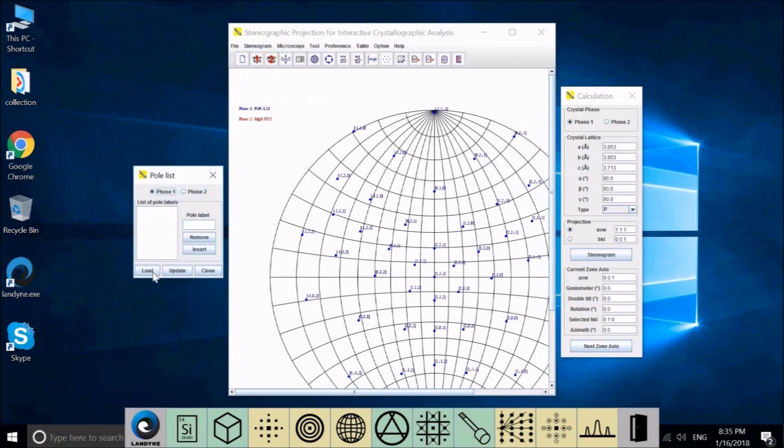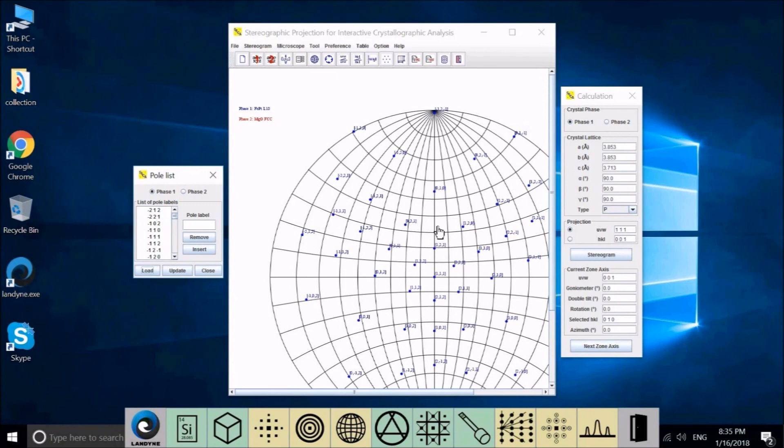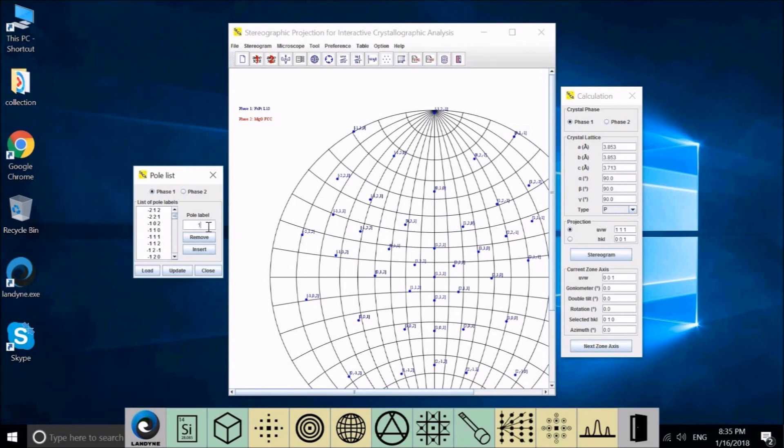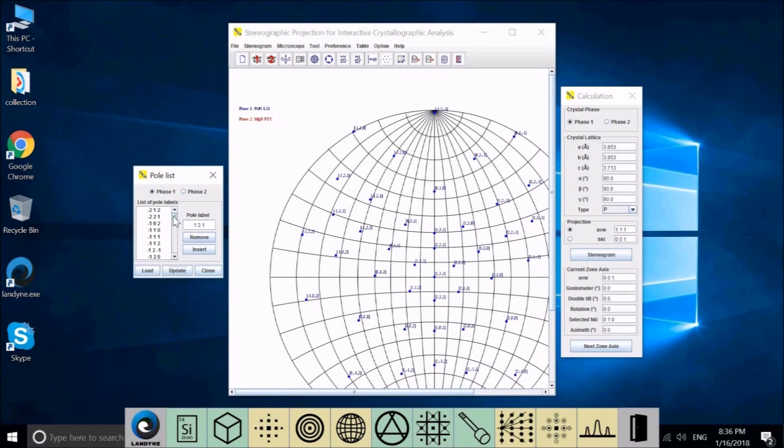Let's first set pole range to 2. Close. Generate stereogram. And we can open the pole list. This is the original one. We reload. So the maximum here number is 2 or minus 2. We want to add 1, 3, 1 pole. We want to see this one only. So we insert. Update. And you can see the new pole 1, 3, 1 here without affecting the others.